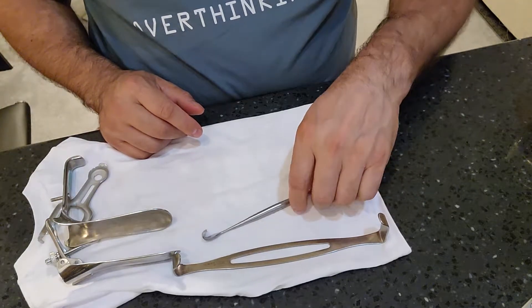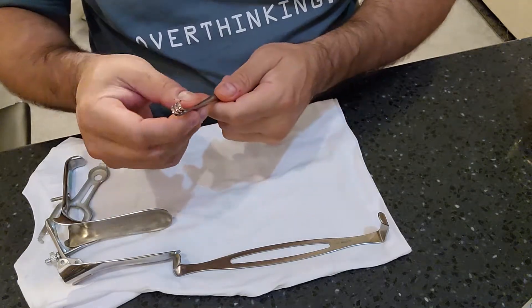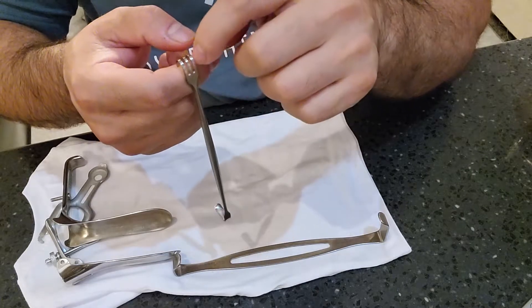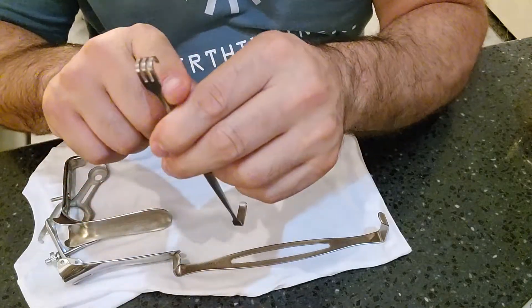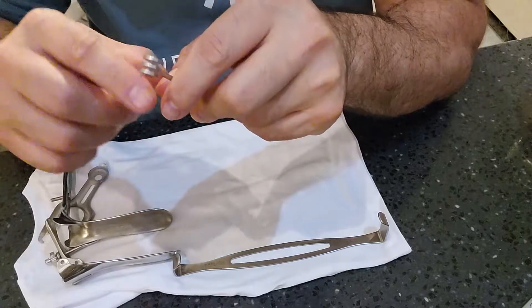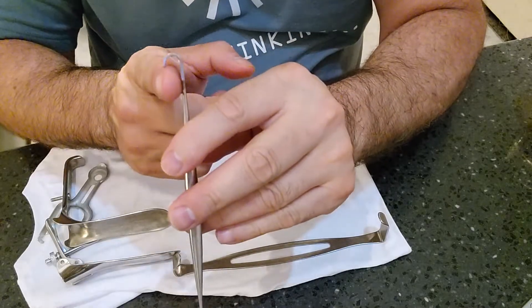For the Matthews retractor and anything with a cat's claw end, these are the working ends, so check them for any bio burden. For anything with hooks or sharp edges, inspect in between each one. View the retractor at an angle rather than straight on — there can be dried blood or bio burden between each finger of the claw.